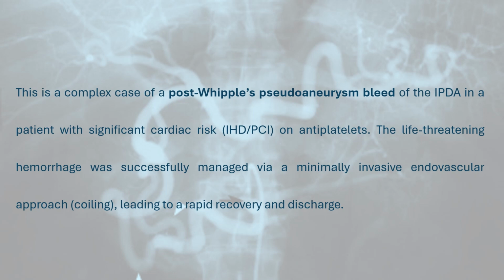This is a complex case of a post-Whipple pseudoaneurysm bleed of the IPDA in a patient with significant cardiac risk of ischemic heart disease and PCI, on antiplatelets. The life-threatening hemorrhage was successfully managed via a minimally invasive endovascular approach, leading to a rapid recovery and discharge.